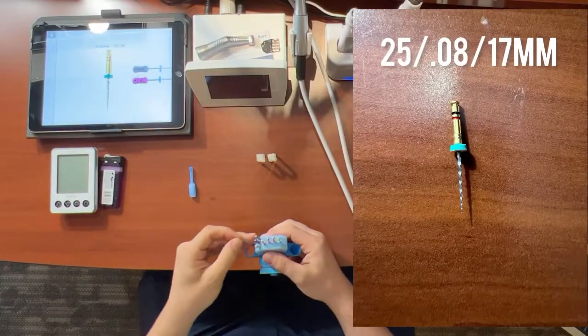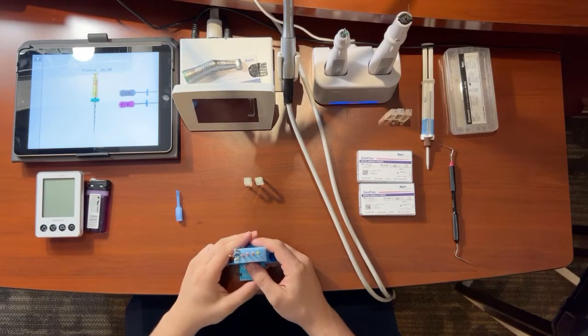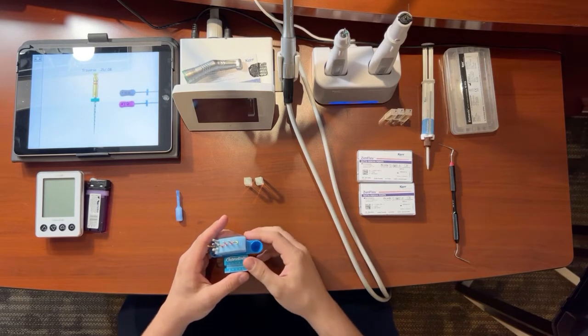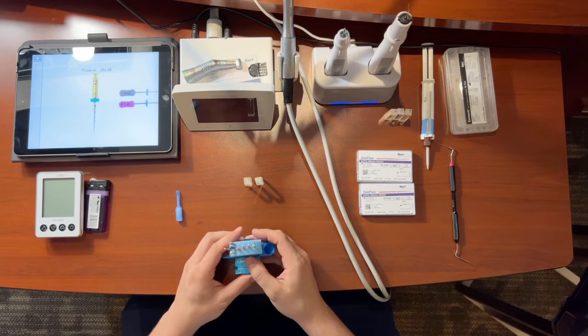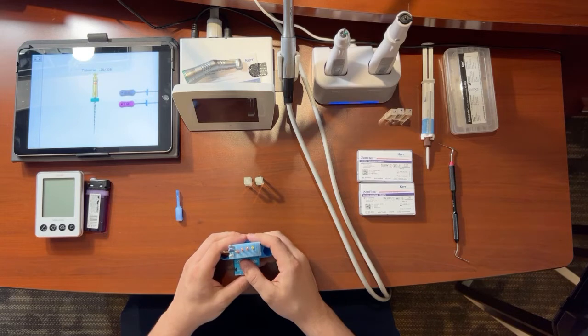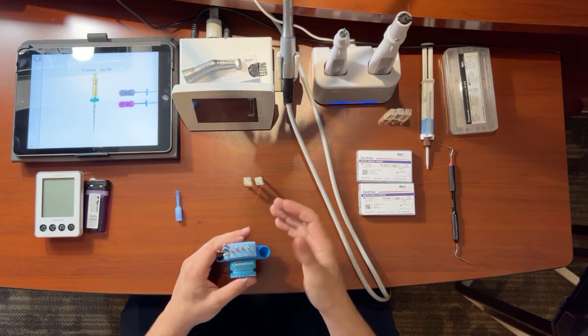Once we have accessed the canals, we want to open up the canals and flare them a little bit with this orifice opener. It's designed to open up that coronal third, coronal to middle third, just to get everything ready to start making your glide path.